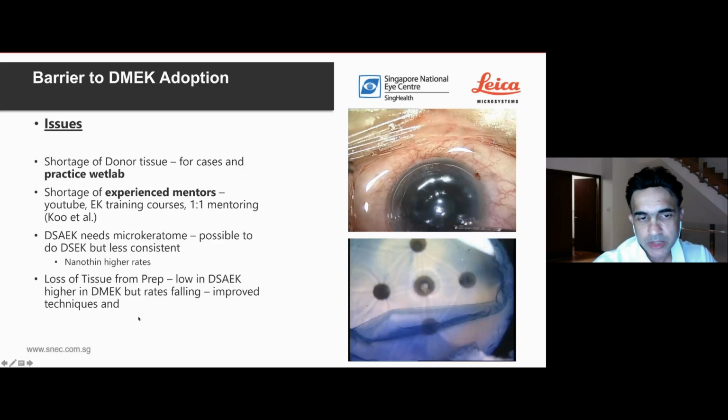There's a diabetic scale that our eye bank uses, and a lot of the eye banks in the US use when they're retrieving tissue. So generally you try to avoid the younger tissue because you know it's going to be a tighter scroll. Avoid the diabetics because you can affect the issue with peeling.